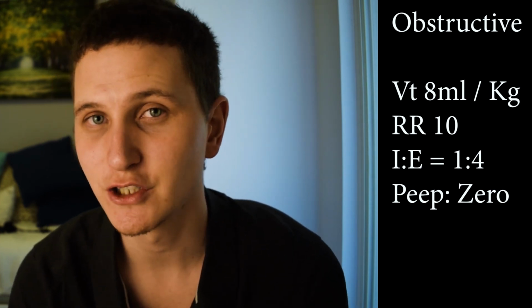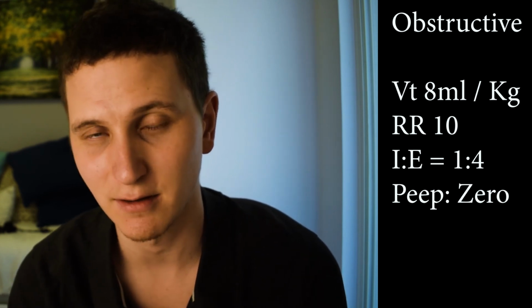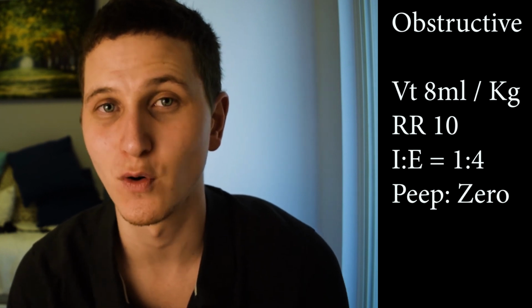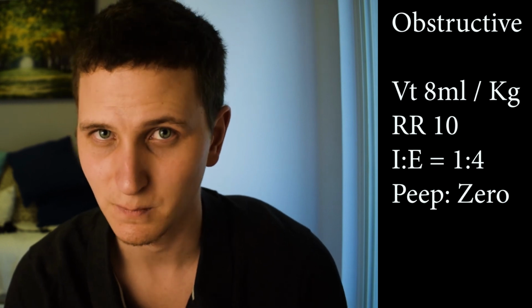Because we're breathing slower, we can allow for proper exhalation. So the IE ratio, the time it takes me to inhale and the time it takes me to exhale, I want a ratio of like 1 to 4. So for every second I breathe in, I want 4 seconds to breathe out. That gives me more time to exhale. Those are the two basic lung strategies. Remember that oxygenation and ventilation are separate. So even with an obstructive lung, you still want to make sure that the patient is getting enough oxygen, but the problem will not be oxygenation, the problem will be ventilation.